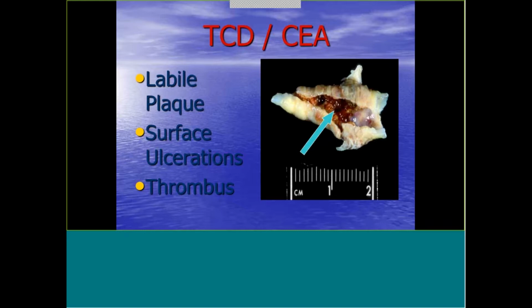These plaques, because they can be very labile, you can hear emboli even when the scrub nurse is scrubbing the neck. The surgeon's out there washing his hands, getting ready to do the procedure. The nurse is in there prepping the skin. If I hear emboli being proliferated just from a skin scrub, I tell the scrub technician, I'm hearing emboli.